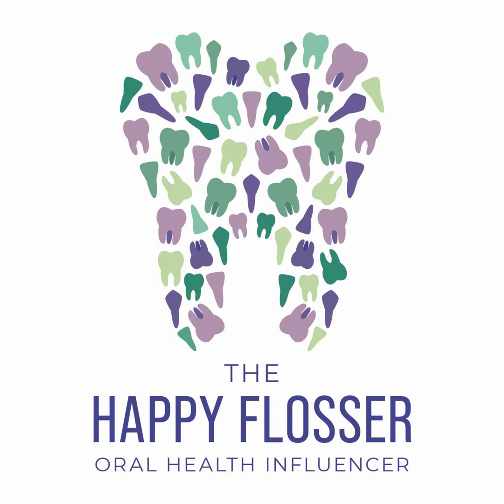So in this episode, we're going to talk all about sensor placement for each of those images and then some of the tips to improve those images because you're going to meet some of those challenges head on when you switch over from Dexter to your real live patient. So if that's something that interests you, then this is the episode for you.